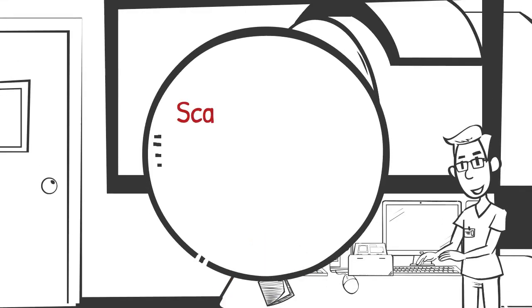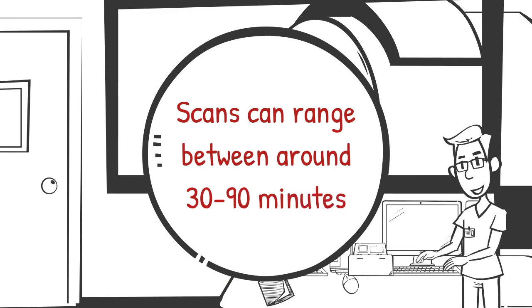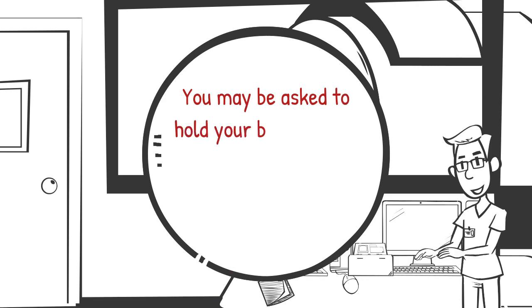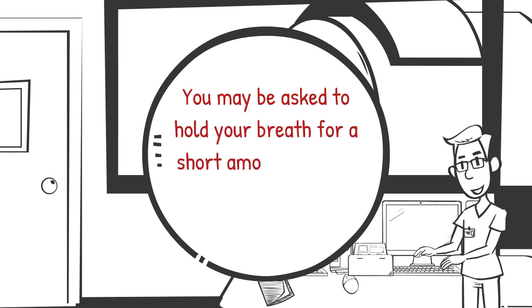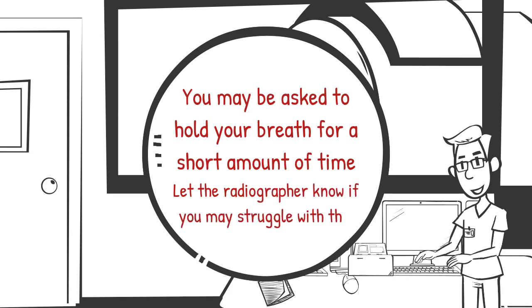As mentioned before, scans can range between 30 and 90 minutes, and you may need multiple scans during your visit. You will be told through the intercom system when each of the scans are about to start. You may be asked to hold your breath for a short amount of time during certain scans, but this will be discussed with you both before any scanning takes place and will also be announced over the intercom system so that you know when you need to hold your breath.